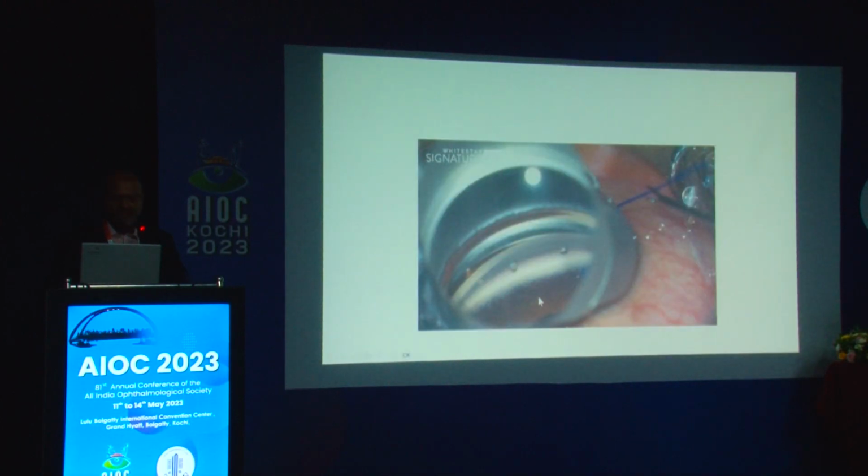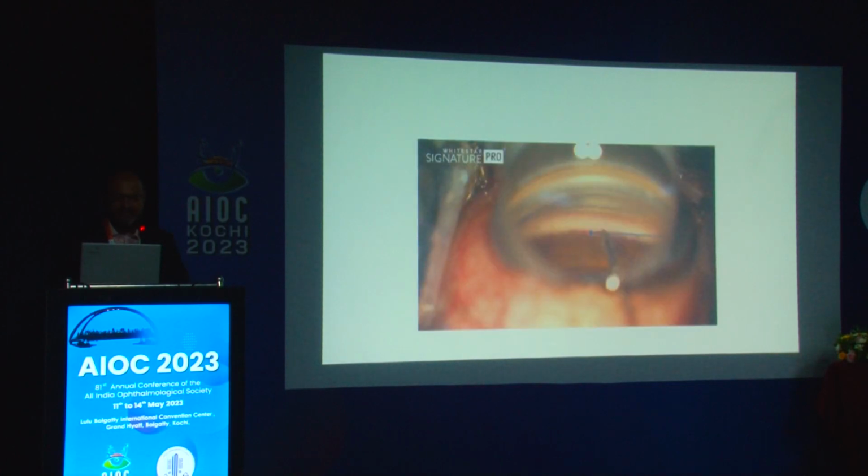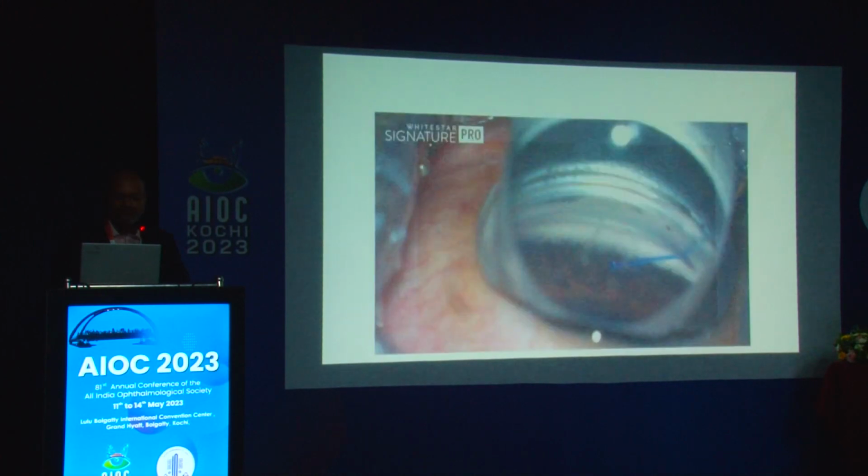And this is an example of a featureless angle. You don't see any demarcation except the ciliary body band slightly, but otherwise it looks non-pigmented, slightly pale. And this is an angle with slightly high iris insertion. You can see that it's slightly high iris insertion, but it will still tear the trabecular meshwork, and you can perform a very good procedure. This is again a high iris insertion.